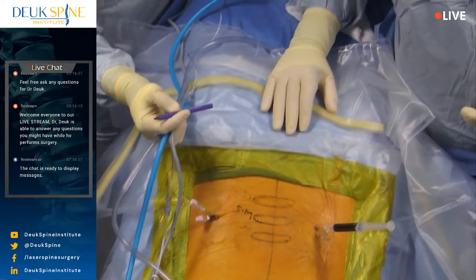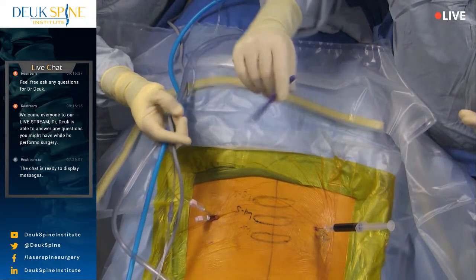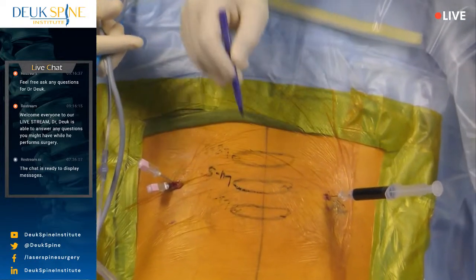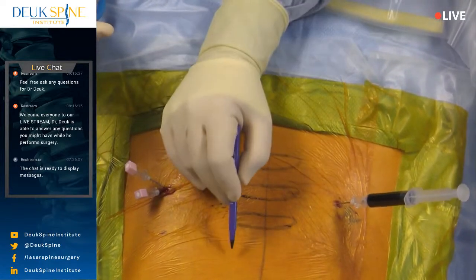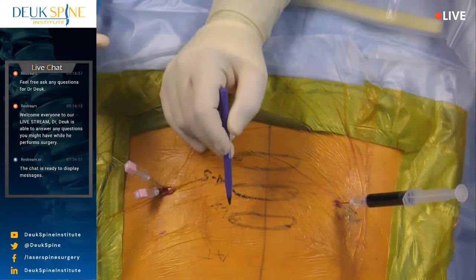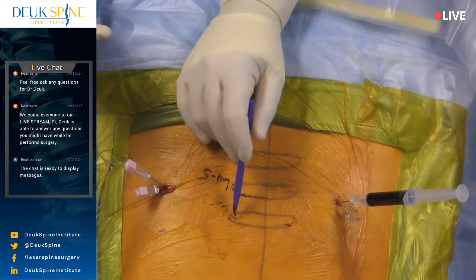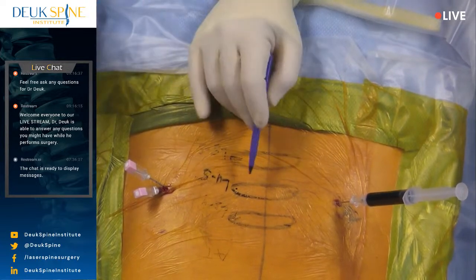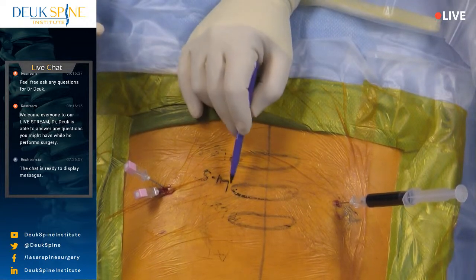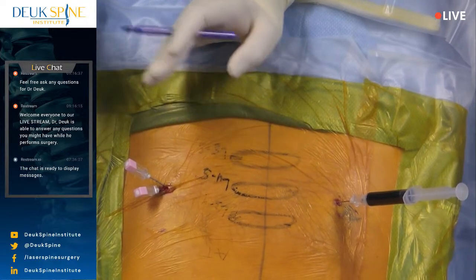Then we had to access the tears. So we're here to repair tears that are happening inside the back of the disc. And every herniated disc in the world, every bulging disc, every degenerated disc starts with an annular tear. It's an annular tear, okay? And that's the wall around the jelly. So this patient had 3 annular tears, one at L3-4, one at L4-5, and one at L5-S1. Now through the tear, the jelly in the center, the nucleus, squeezed out and got stuck, and it's causing inflammation. That's where the back pain comes from. We're gonna unstick that jelly and remove it with the laser.